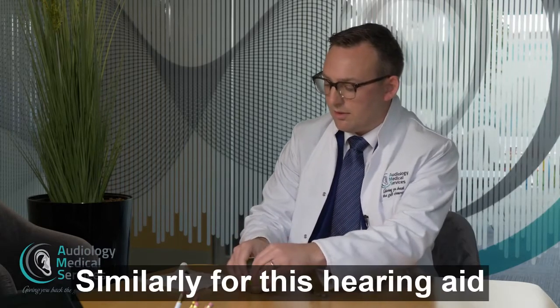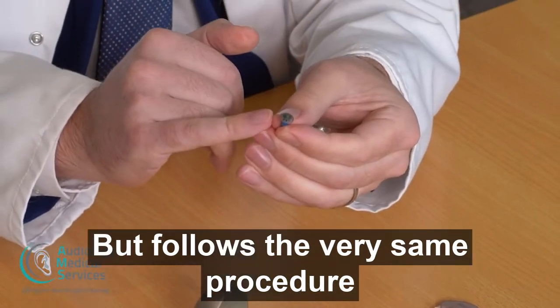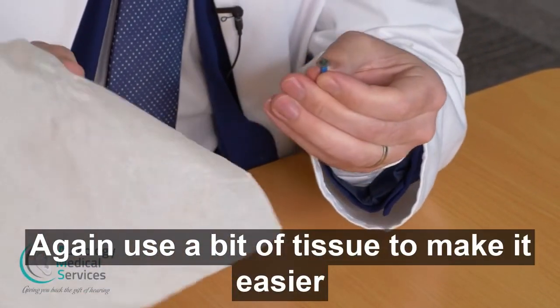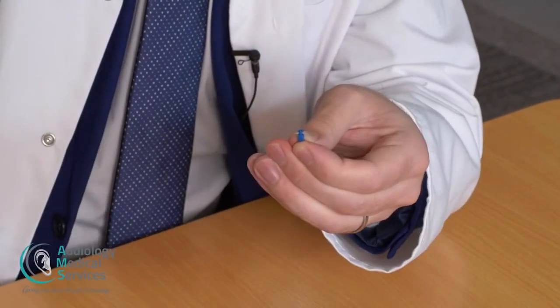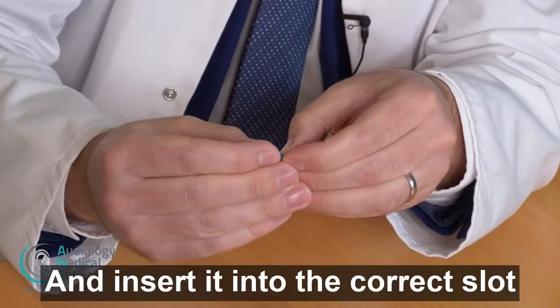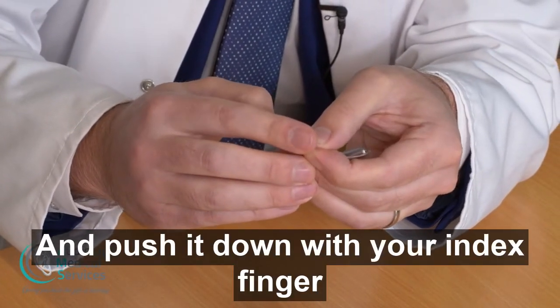Similarly, for this hearing aid it's a different type of dome but follows the very same procedure. Again, use a bit of tissue to make it easier. Pinch and pull the dome away. Pick up the fresh dome and insert it into the correct slot and push it down with your index finger.